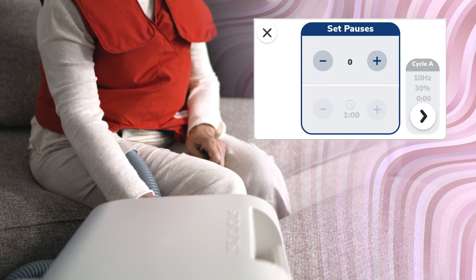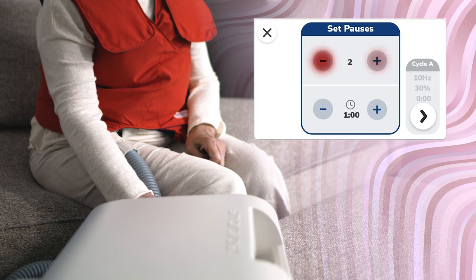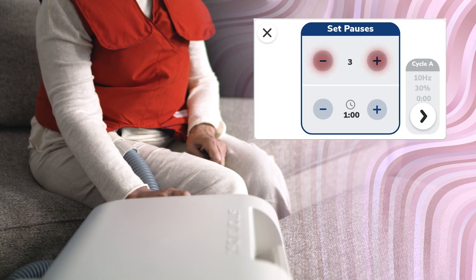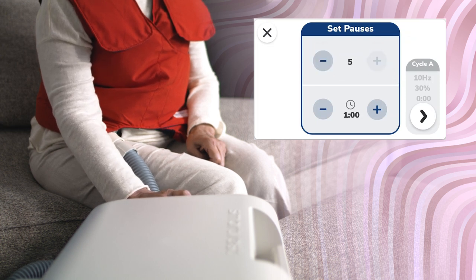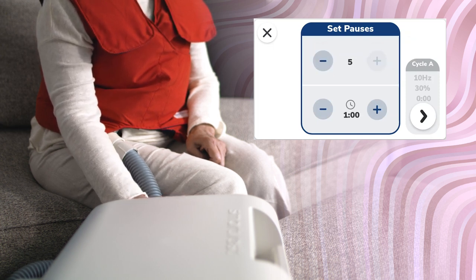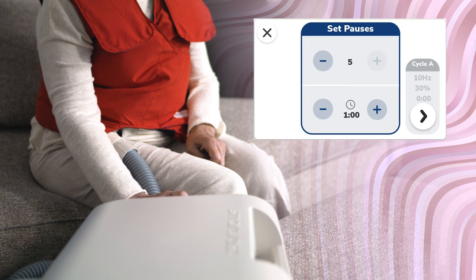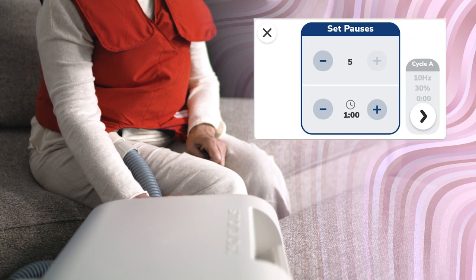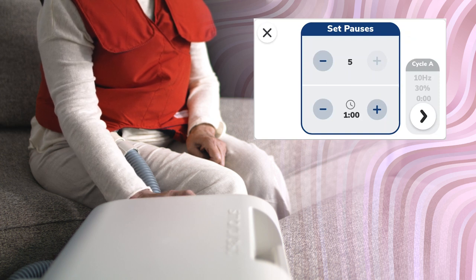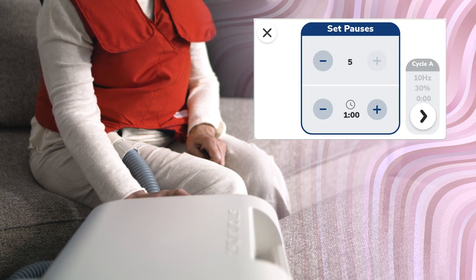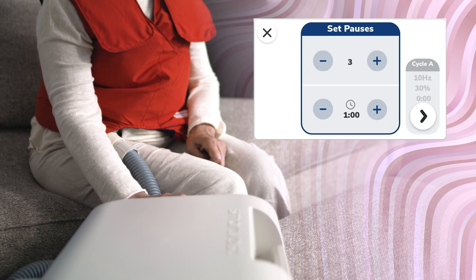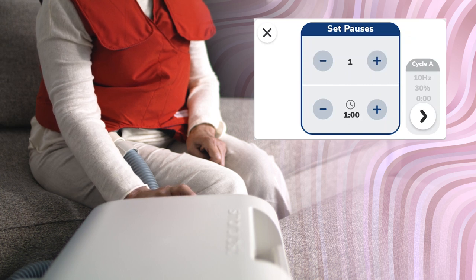To adjust the pauses, use the plus and minus buttons going from 0 to 5 to customize the number of pauses in therapy. A custom selected number of pauses will be evenly spaced out throughout the program duration based on the number selected, without regard to the cycles.